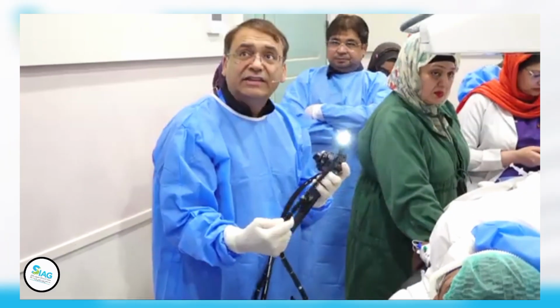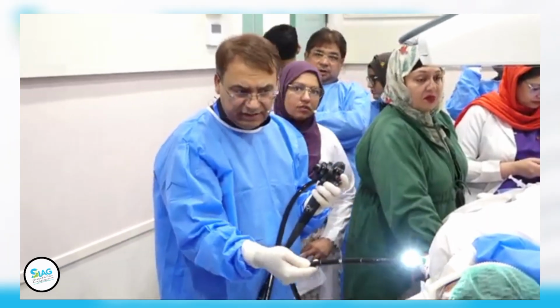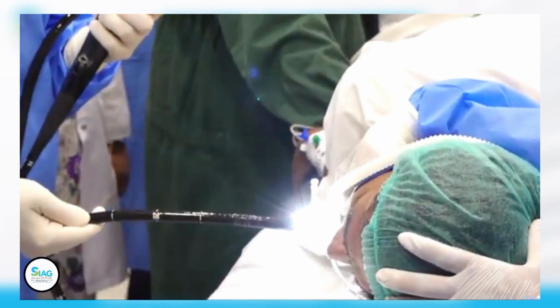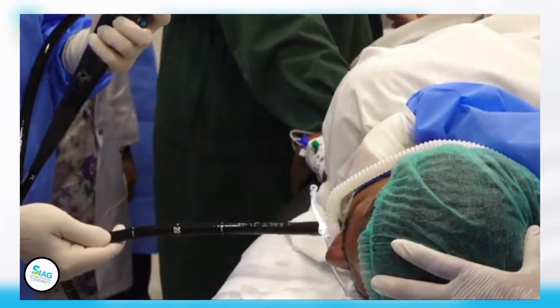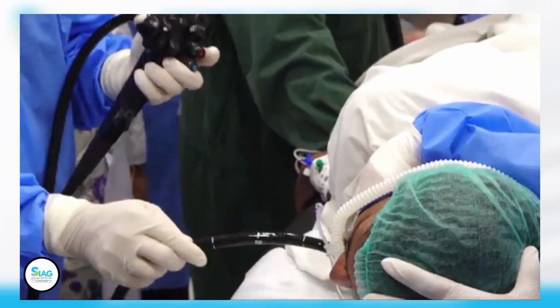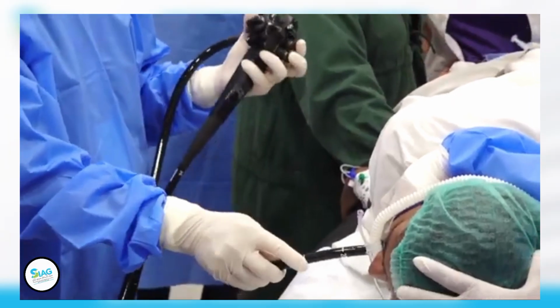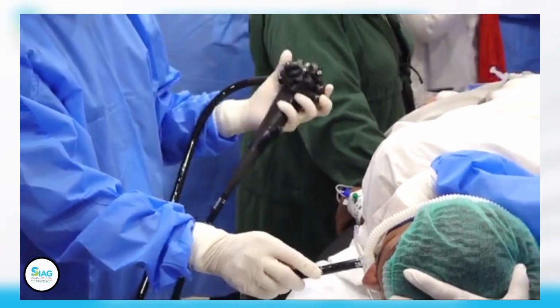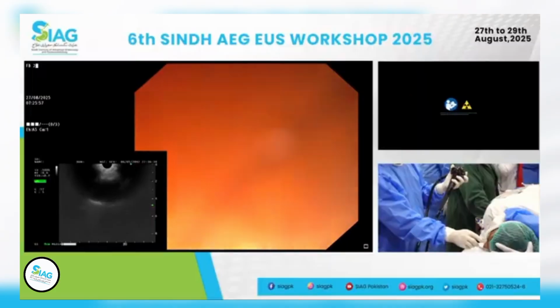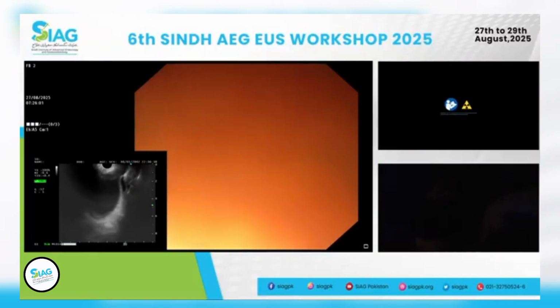And so you see that, if you can show it at the end. The light is towards the eyes of the patient. So I'll go above the back of the throat, and from there I flip. When I flip and then gently rotate the scope, you will see that I should not have any problem passing through the upper esophageal sphincter. You can show me. So you see it, turn the light on.